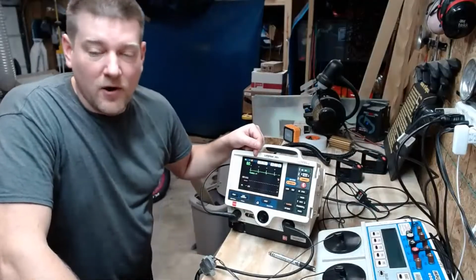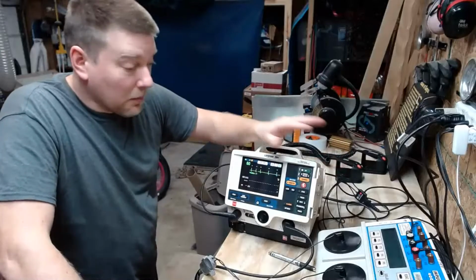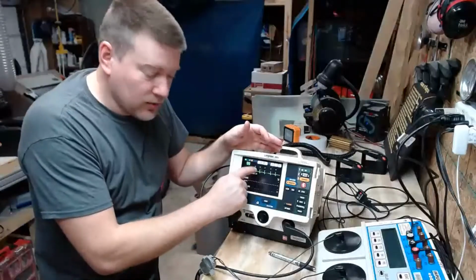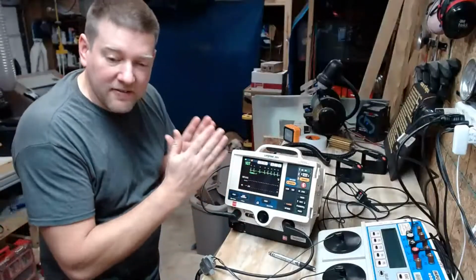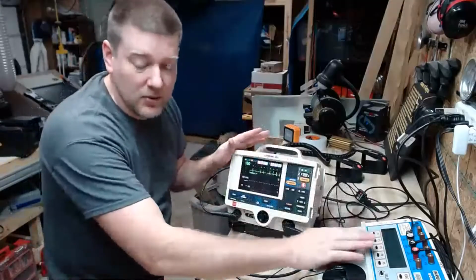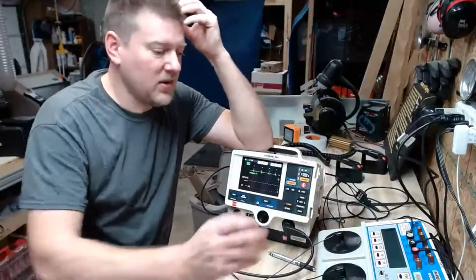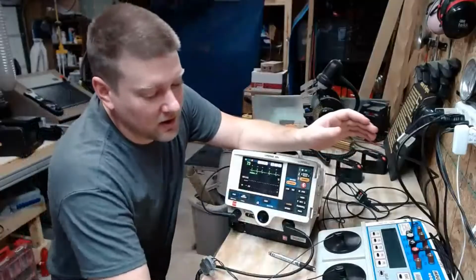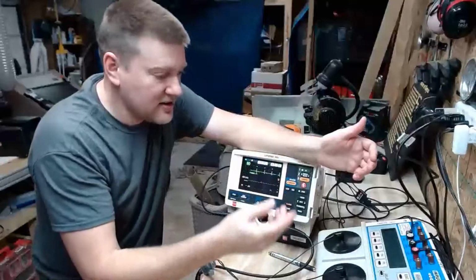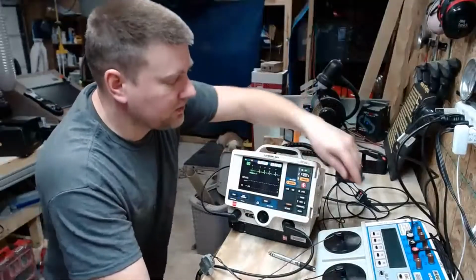So it's looking for the R wave, and in order for it to be an effective defibrillation, a more effective defibrillation, it has to be a discharge of energy right after the peak. And you have 60 milliseconds from that peak for it to discharge. And that is something that we actually measure with our analyzer. And it's one of the most important measurements that we take when we do our PM, the cardio sync time. So we measure the amount of time it takes for it to energize all the way up to its maximum energy, which for this one is 200 joules.